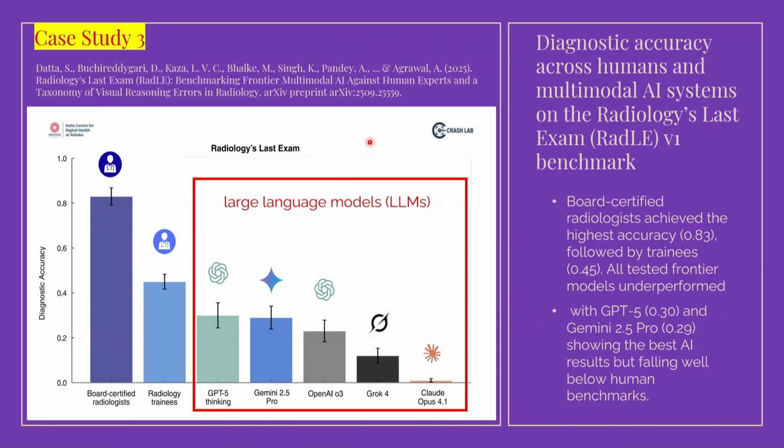Number 3 is about whether we can use other large language models to replace the AI. But you can see from this chart, the performance is far from the radiologist's performance. So the human can do better than other large language models, such as ChatGPT.